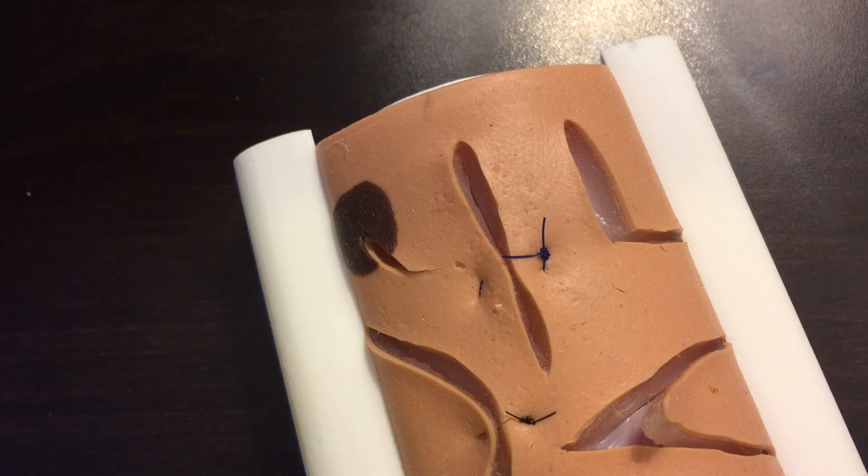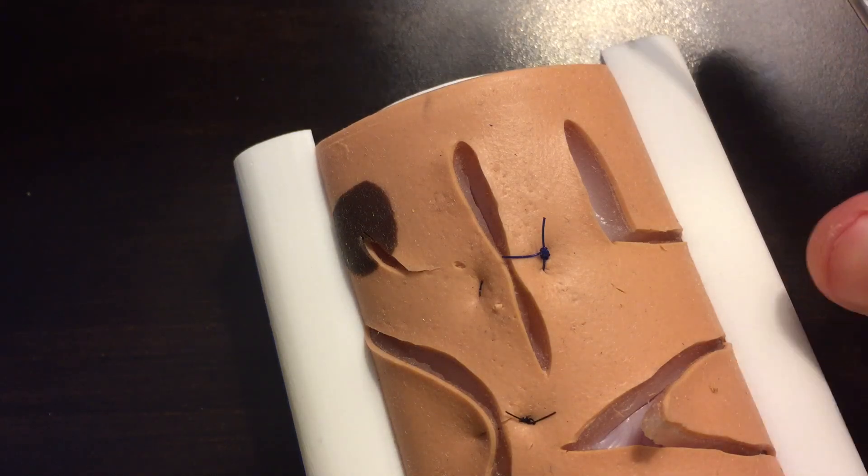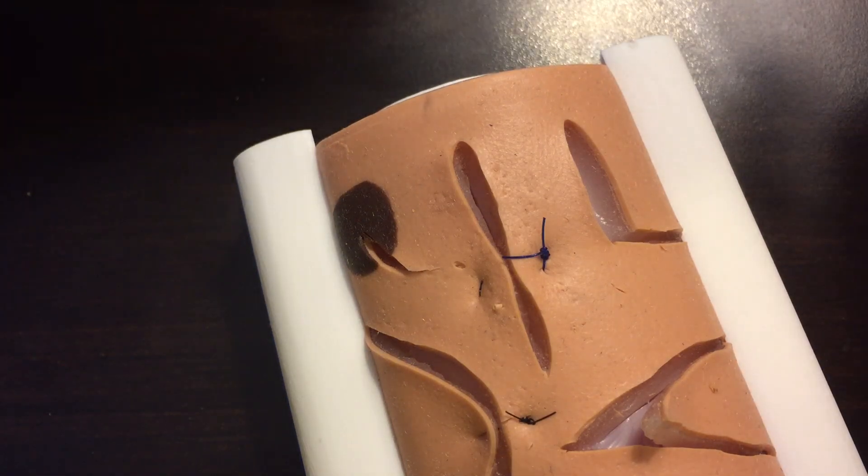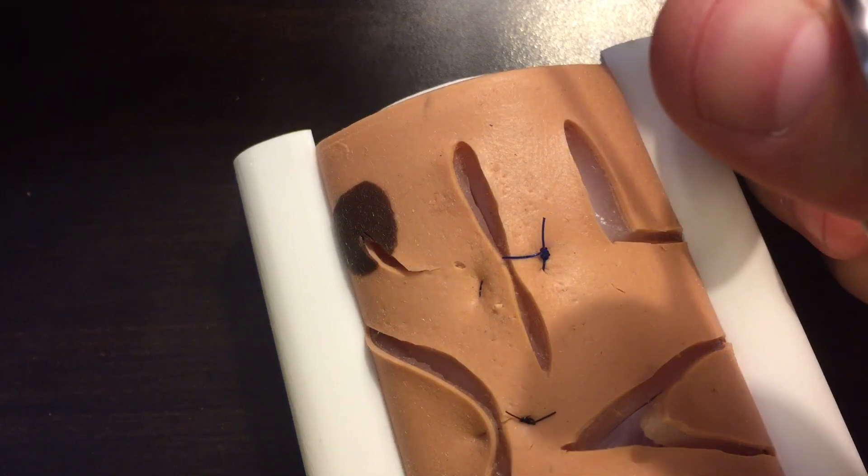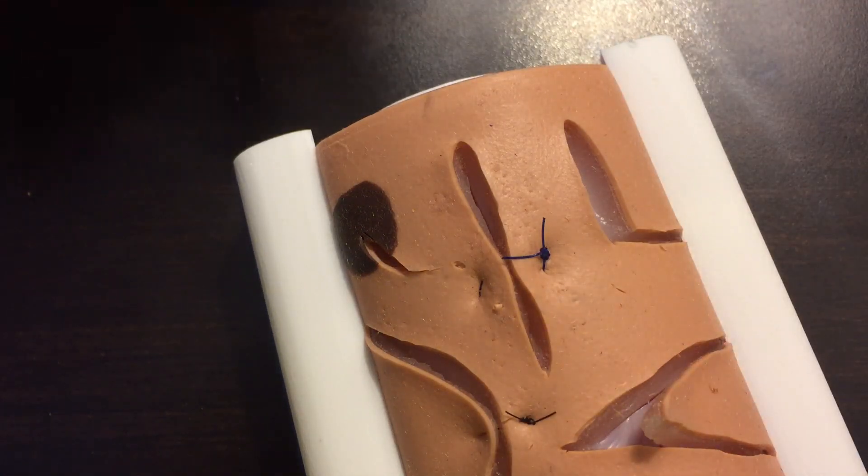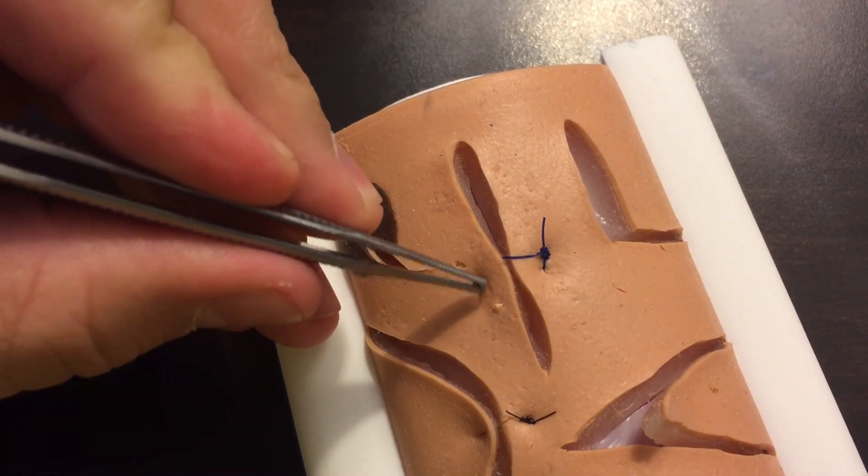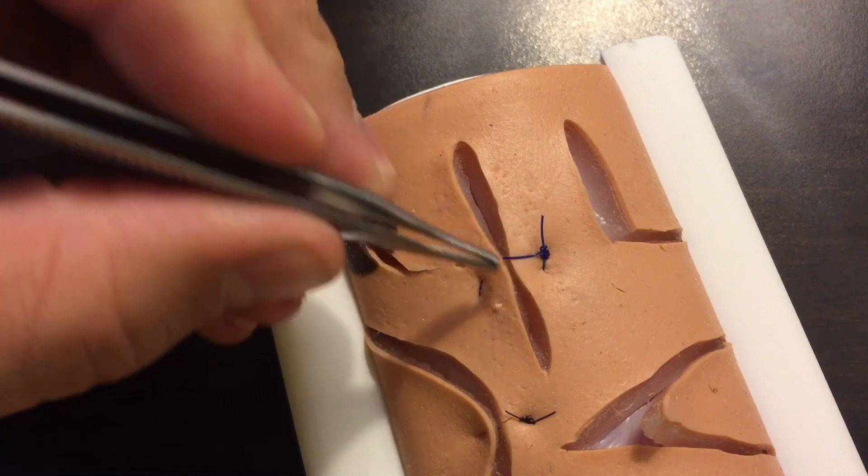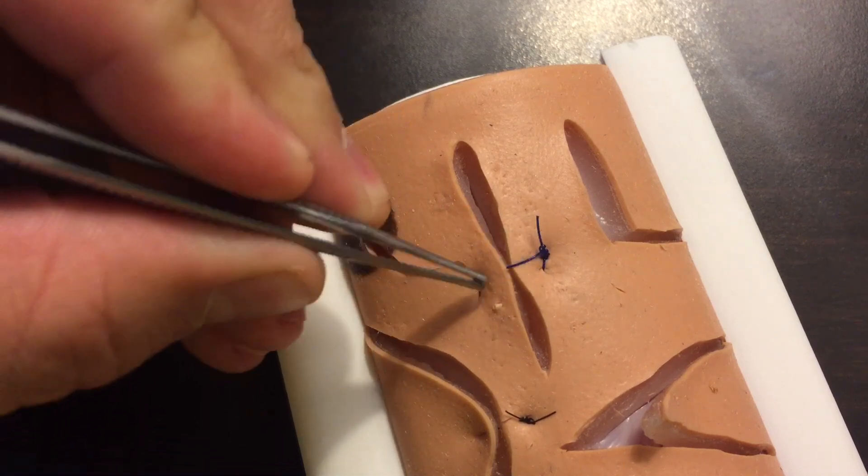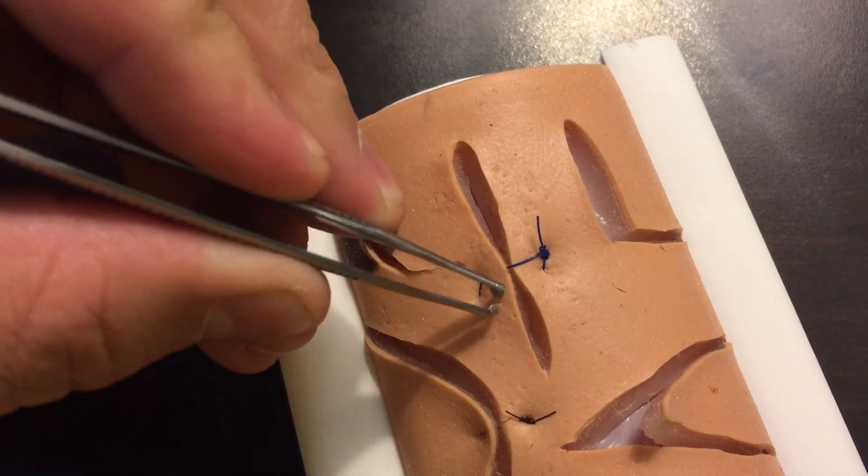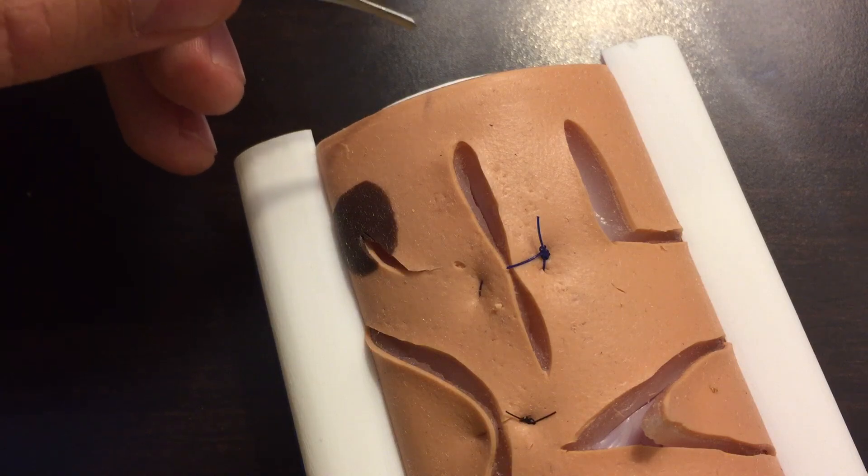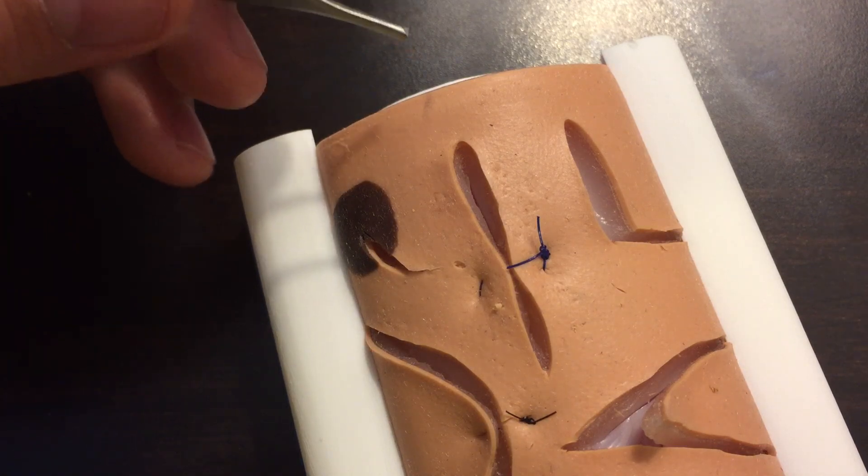The one caution I would add with a horizontal mattress like this is that if you pull it too tight, it creates strangulation of the tissue off to the side. You can kind of appreciate that here where if you pull it too tight, it's going to bunch this area up. You don't want that because that'll inhibit healing and can cut blood supply to that tissue, and you can get some necrosis.